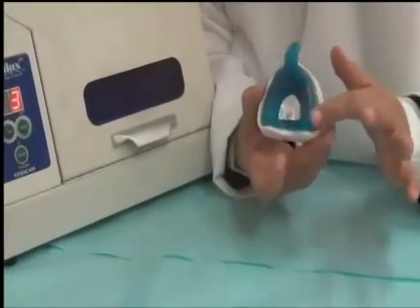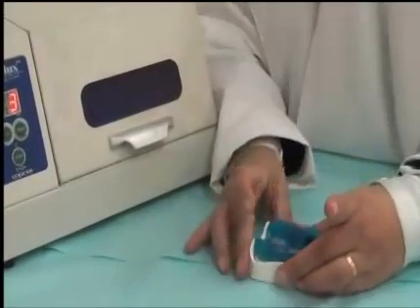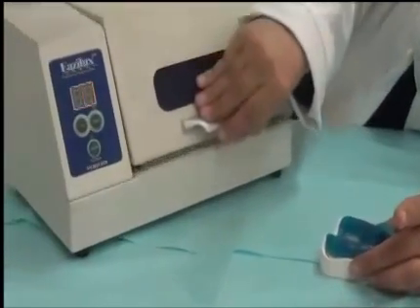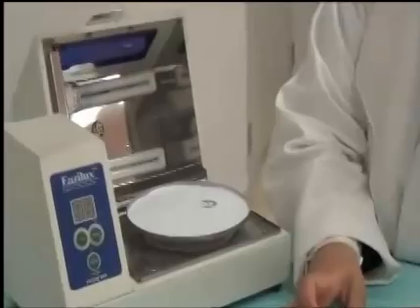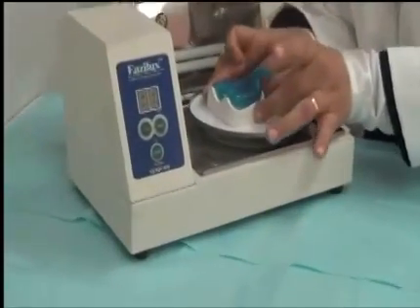We also make sure that there are no projections inside the surface outline, because it's easier to remove them when the acrylic is soft than in the finished material. We place it inside the light cure.